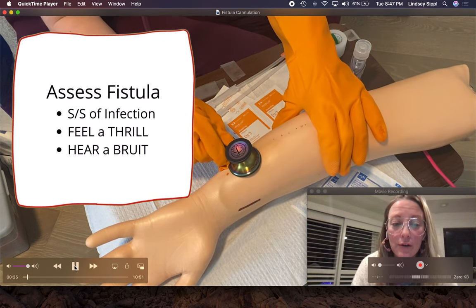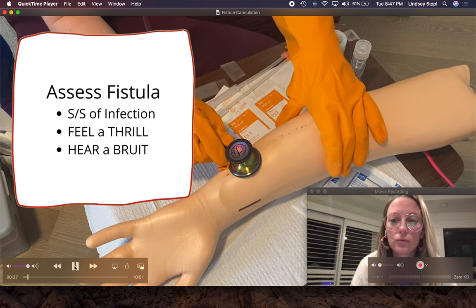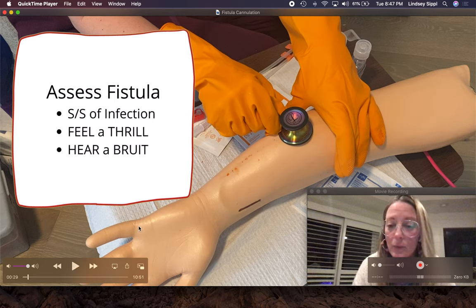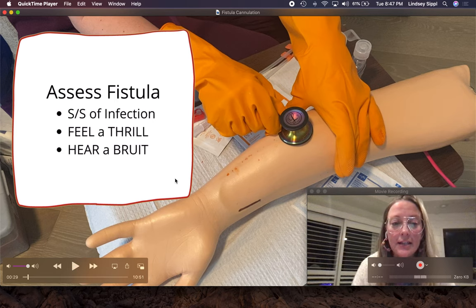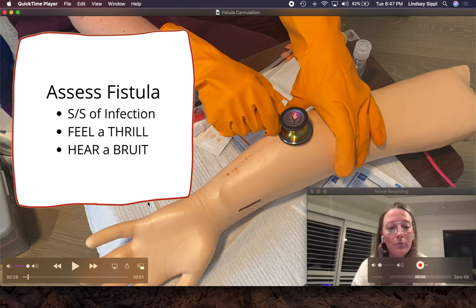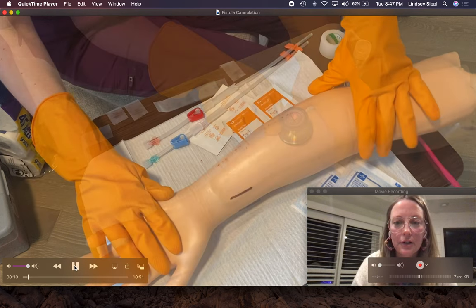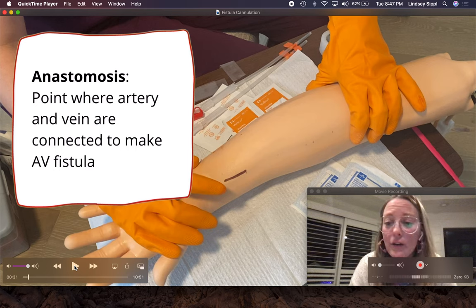Next, I'm going to hear a bruit. I'm going to listen for any whistling, any decrease in the thrill or bruit, and any significant changes — I am going to notify the provider. If I do not hear a thrill or a bruit, I am not going to cannulate, because that fistula is not working and you will just get blood clots.